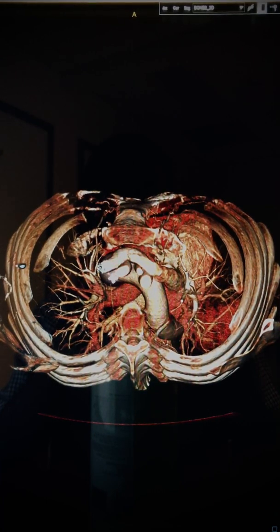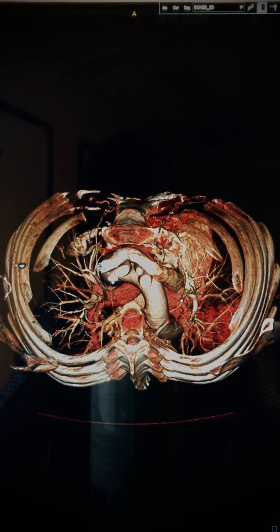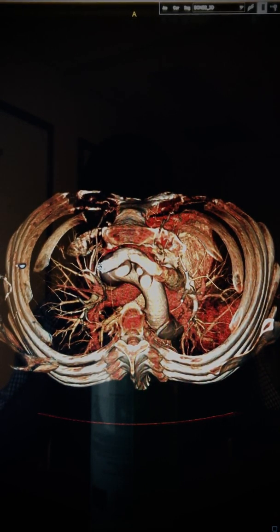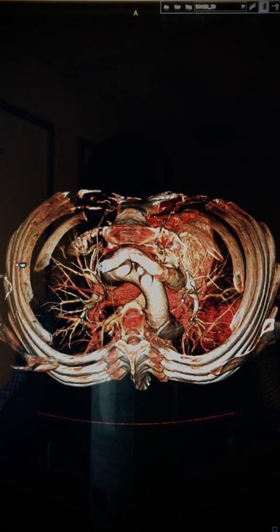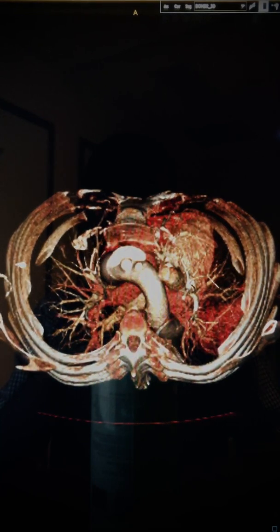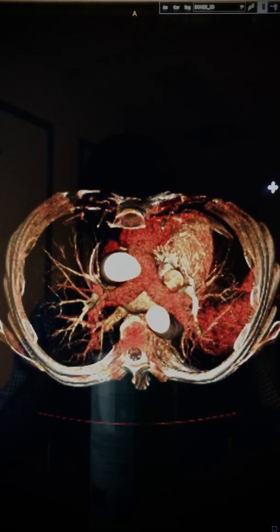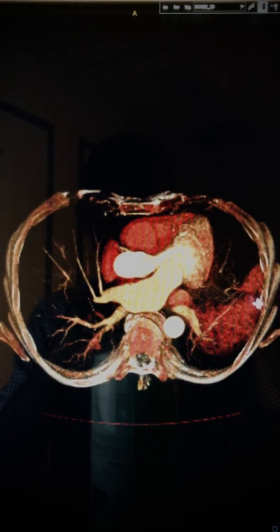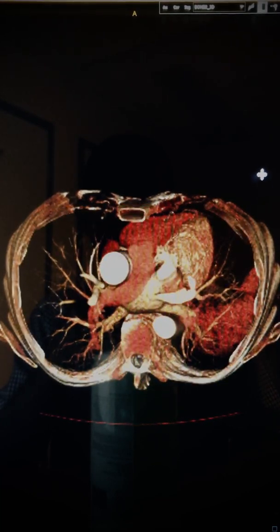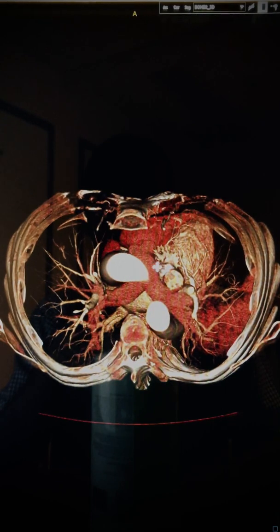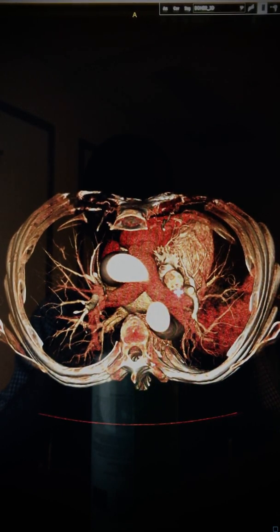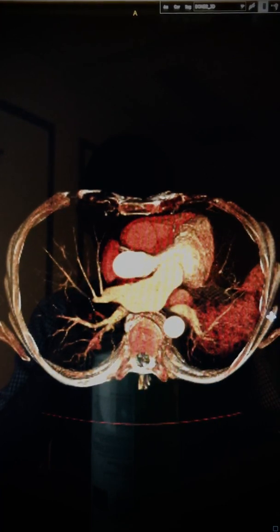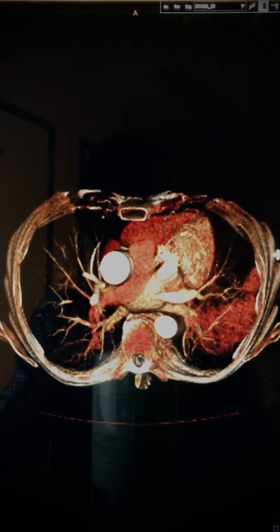So in this patient, there is no normal right-sided superior vena cava, but an anatomical variant where there is a left-sided superior vena cava draining into the coronary sinus. In the context of a left superior vena cava, the commonest drainage pattern is into the coronary sinus.